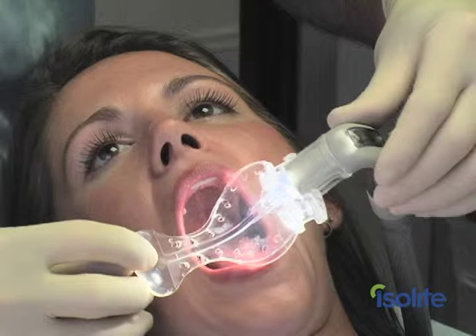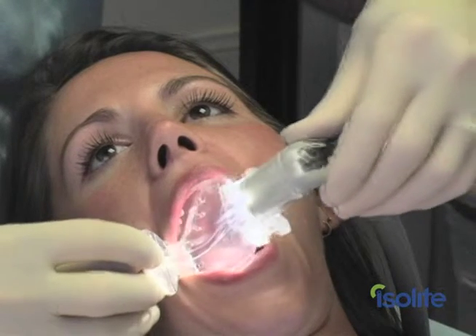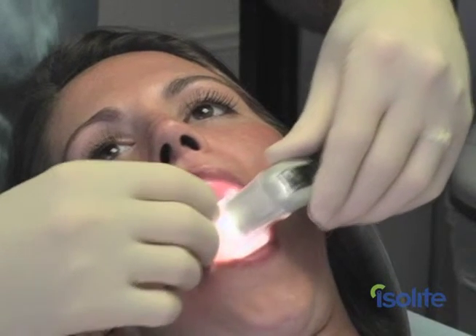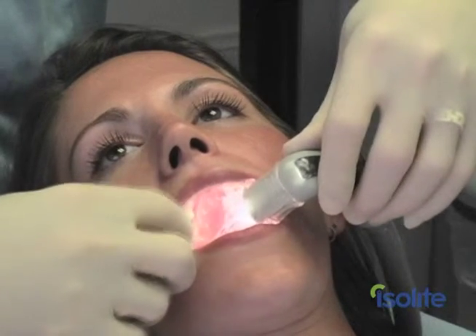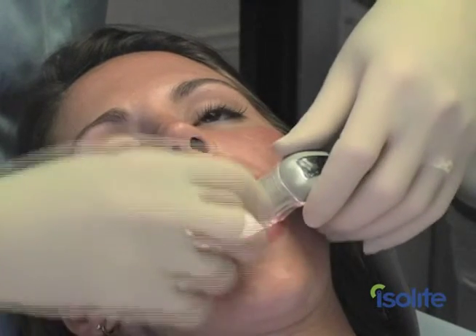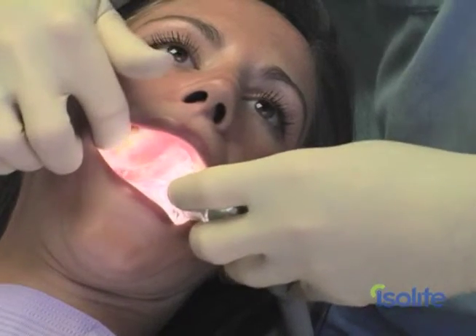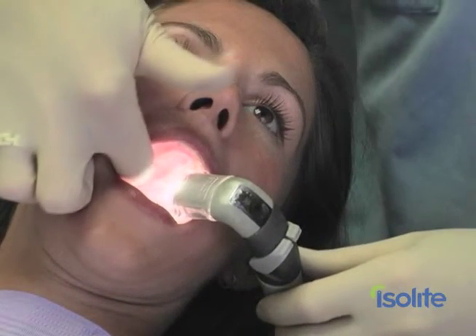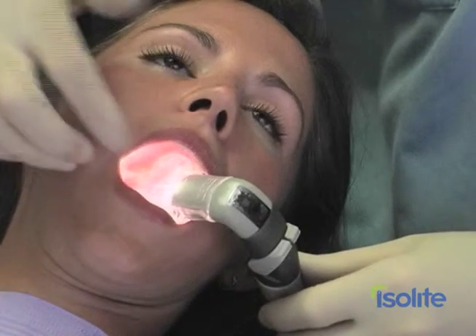Holding the Isolite with a feather-light touch between the thumb and the fourth finger — not like a hammer — position the isthmus at the corner of the mouth. Instruct the patient to open wide; remember, patients can usually open wider than they are initially instructed. While folding the cheek shield forward towards the tongue retractor, gently slide the isthmus into the cheek area to avoid contacting gag-sensitive areas. Continue moving the bite block towards the center of the mouth just behind the anterior teeth; be careful not to catch the bite block on the corner of the mouth. Move the bite block onto the occlusal surface of the teeth just distal to the mandibular cuspid. Instruct the patient to gently rest on the bite block. Place the isthmus behind the maxillary tuberosity resting on the retromolar pad and tuck the cheek shield into the buccal vestibule.